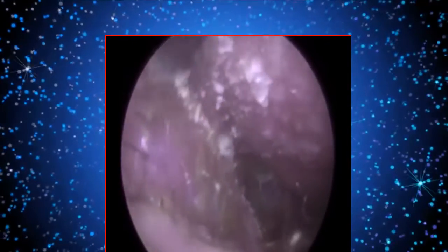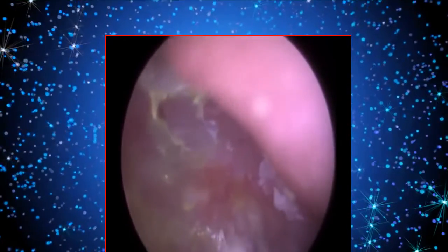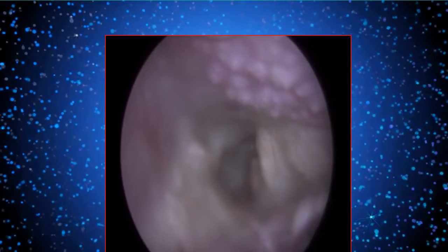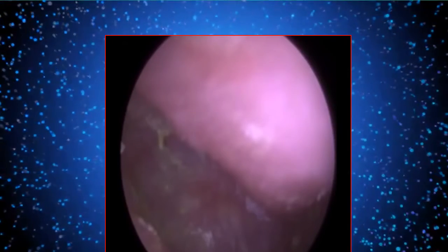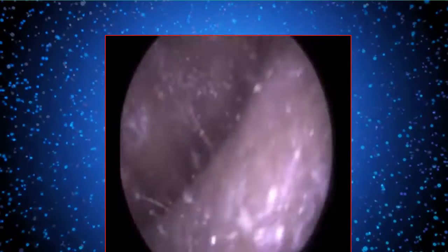Brilliant. And you'll see a before and after shot in a moment. I think that went down well in my last video. So that's how the patient attended. When he came 7 weeks ago, you couldn't see that even. It was that swollen. So it was a lot better today. You can see the swelling, you can see the eardrum clear. That's all clear. Same patient, just the right ear.